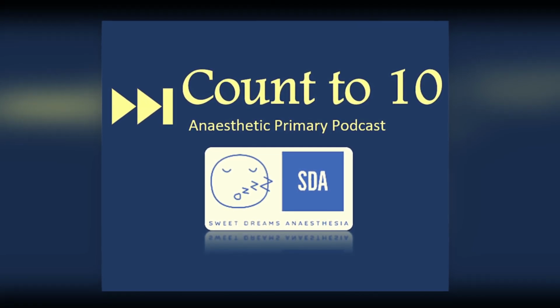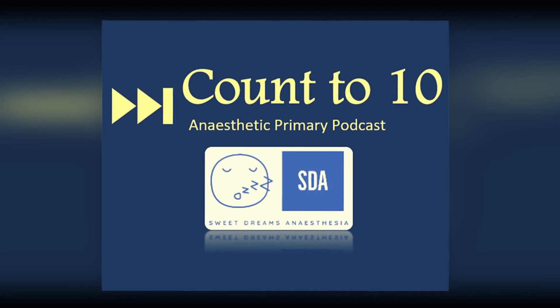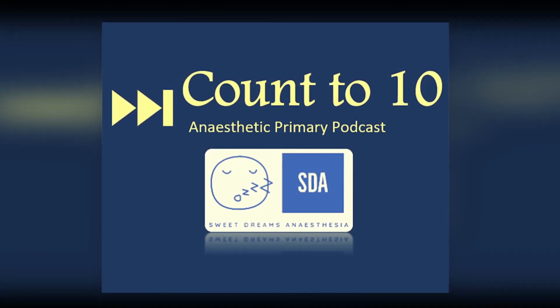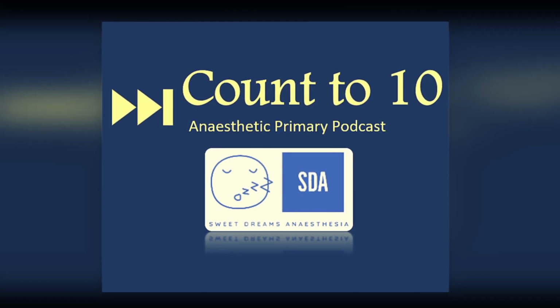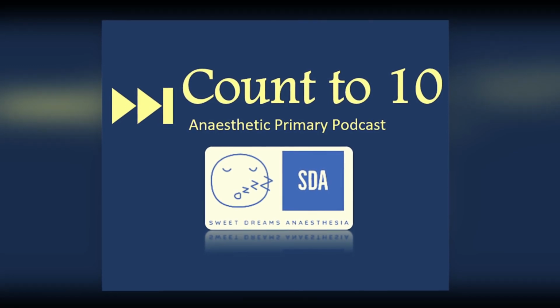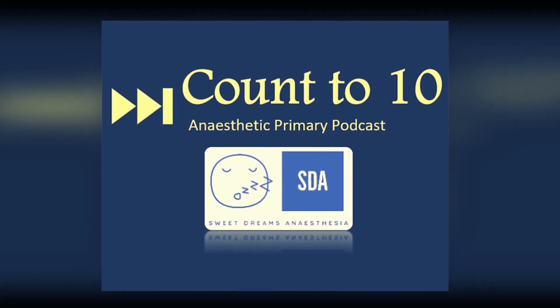That's a really easy viva question you can get, and someone can just ask you how often do these lights go on. You don't need to remember the exact number, but if you know 5 to 10 milliseconds, the next question might be, why is it that frequent? And it's to decrease that error by having multiple repeated measurements. Other simple errors that can occur can be that the probe wiring might be disconnected or faulty, or what the probe is measuring might be different.